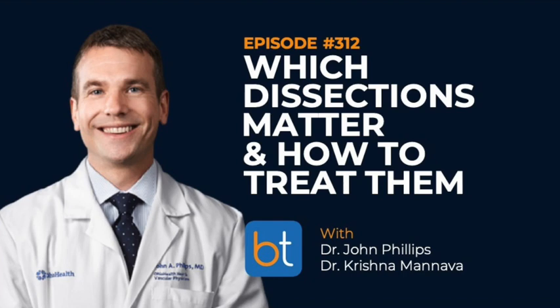But I think the sweet spot for them, in my opinion, is some of these no stent zones, as well as the tibials below that upper third. Because I've put in a fair share of coronary stents in the tibials and they come back crushed. I've got one guy who needed an amp, and they put a tourniquet on his leg and he lost the toe, and then we lost the stents as well because they were crushed.